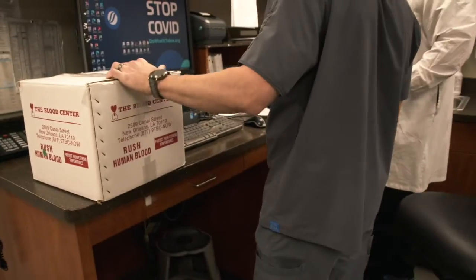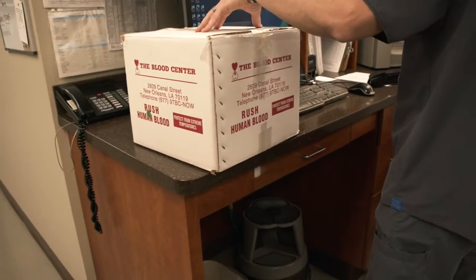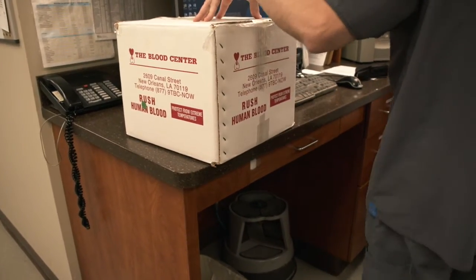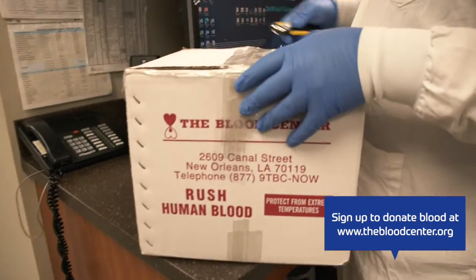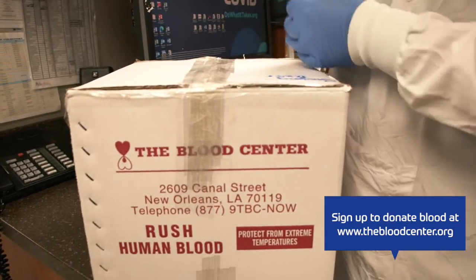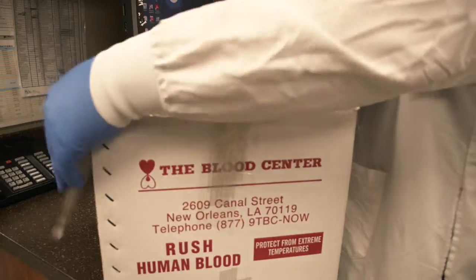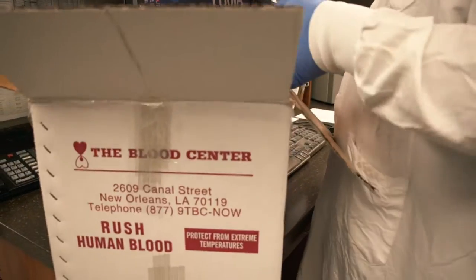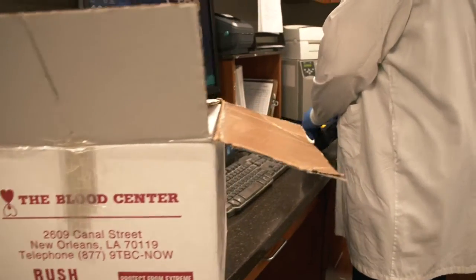The doctor may then recheck the levels on some of the other instrumentation we've seen in the lab, and then monitor that patient's progress. When the blood arrives here in the blood bank, it's checked in by our technologist, scanned in the computer to maintain proper inventory, and all the blood we have here on hand is evaluated on a daily basis. We have to keep a proper number of minimum inventory on the shelf so we can ensure through all of our surgeries, potential traumas, and our inpatients, we always have an adequate amount of blood available on the shelf for our patients.